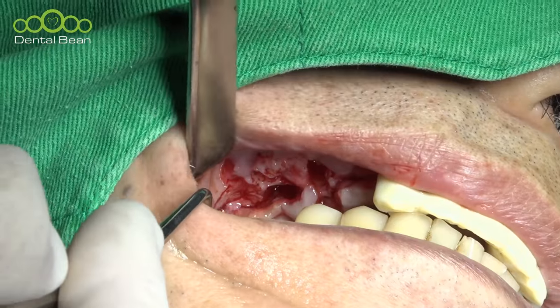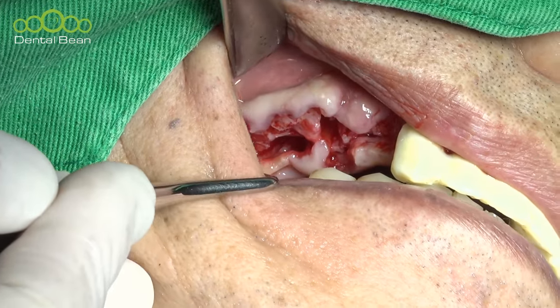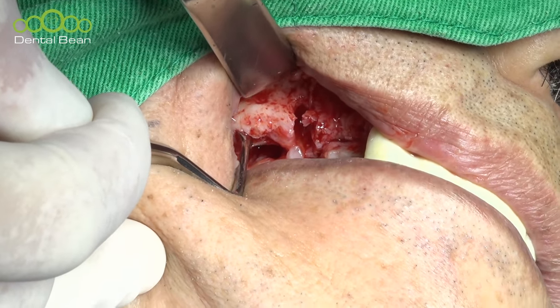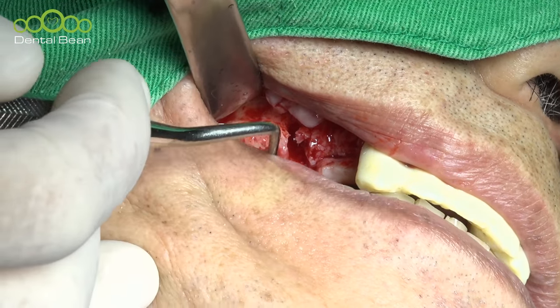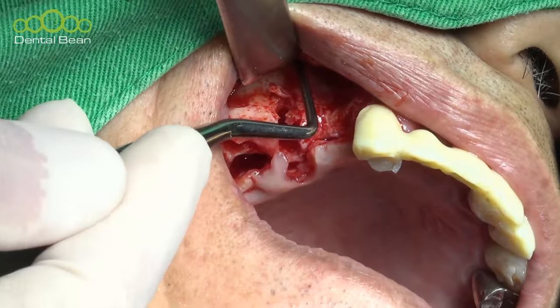The lower right side, I will apply one implant. So make some occlusion. The first molar area is okay. Open, please. This is a very easy case.